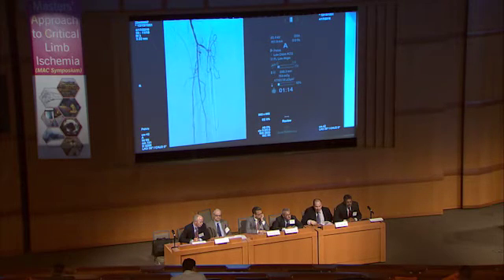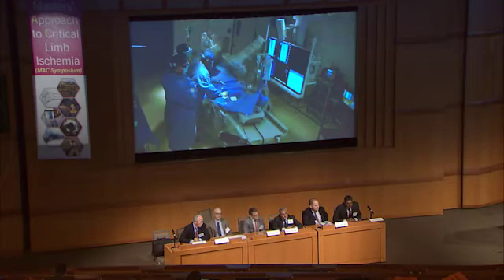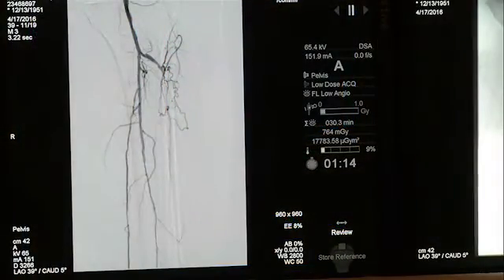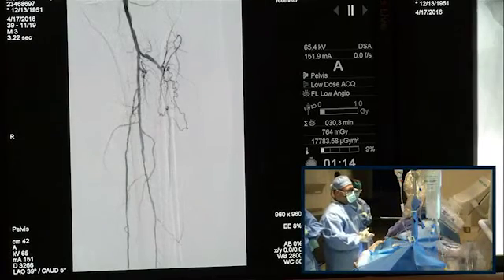I would actually. I'm sorry. I know, Dr. Walker, but let me ask you a question. So you did angioplasty of the TP trunk here? That looks good. The PT, yeah, that's nice, diffusely, so the PT now looks even better. So the question is, do you want me to go after some angioplasty of the PT, or should we try to open the AT, given the situation?